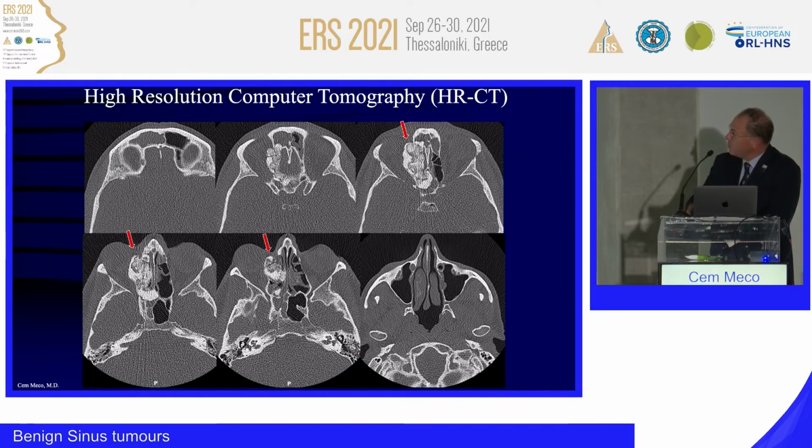So an external approach could also be used in this one, as it is really going very anterior, so from the skin you can really feel it. Or an endonasal endoscopic approach can be used, a Draf type 3, then watching out for the skull base, ethmoid arteries, CSF leak, sphenoidotomy. This is from the anatomical dissections, so it generally heals perfectly later on, the incisions. But as you don't really come from below, the flow is generally impacted and could end up with a mucocele, and you may really need to sacrifice the supraorbital nerve.